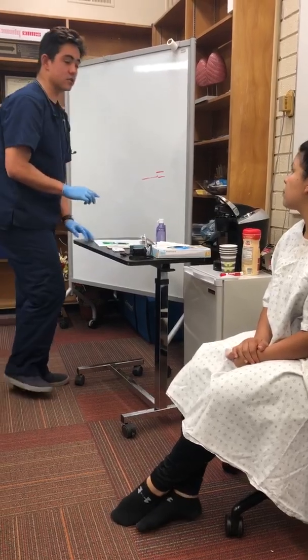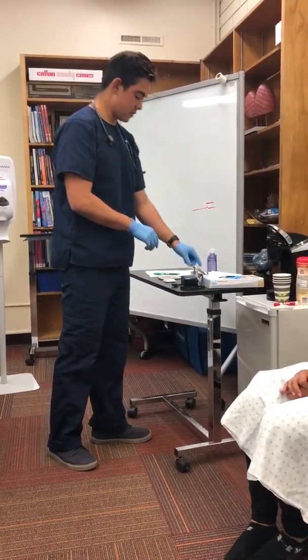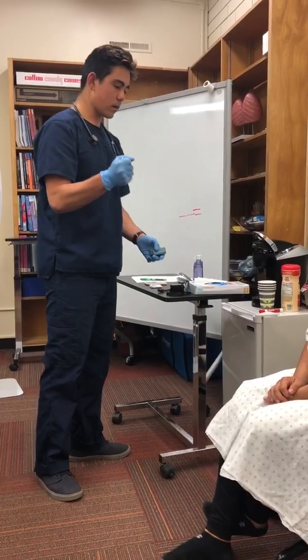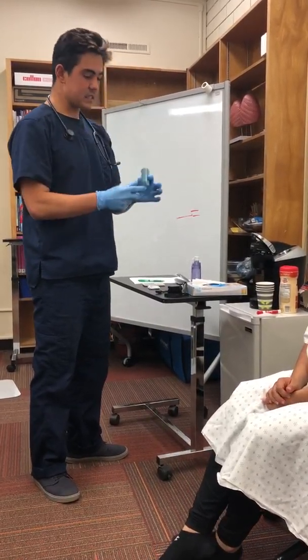Okay, so we're going to go ahead and do the treatment, and we'll note improvement from there as well as your baseline vitals. So this is our albuterol. This is going to be the treatment that we're giving. We're going to want to warm it up and shake it since it hasn't been used in a little bit. It's a fresh dose. This is your actuator.